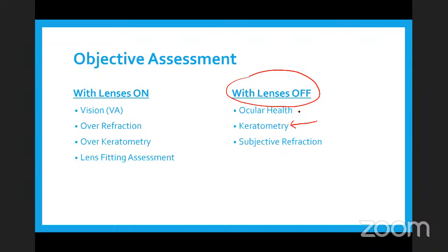Practitioner's preparation is the key. So you have the patient records. You had measured 42, 44 before you delivered the lens. And then suddenly after wearing for 4 hours, the keratometry changes to 45, 46. You understand that keratometric changes are possibly because of the lens fitting, right? So that gives you a clue, and that gives you an idea on finalizing a lot of things later on.